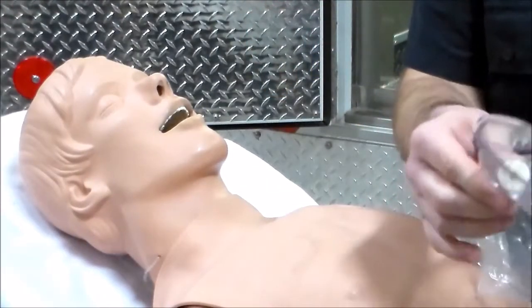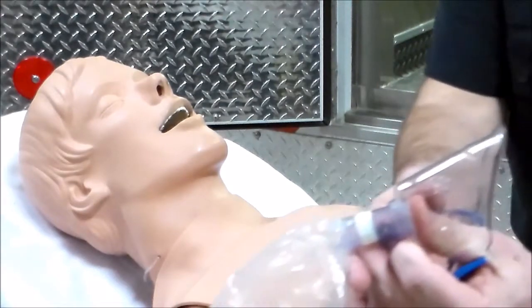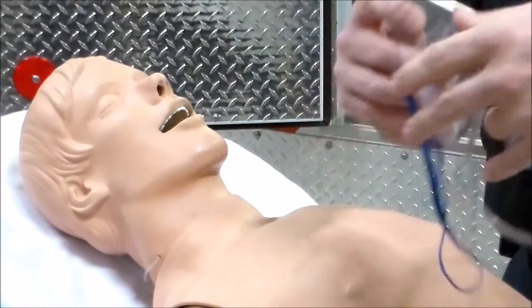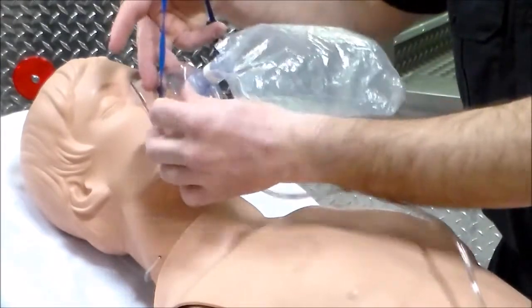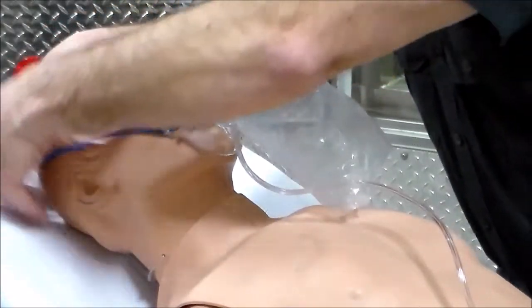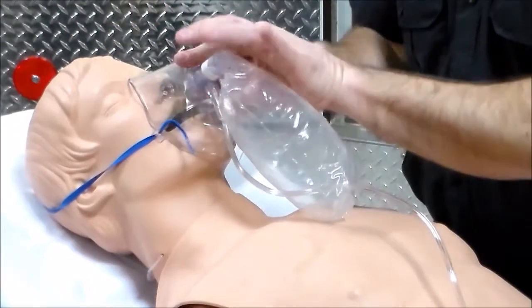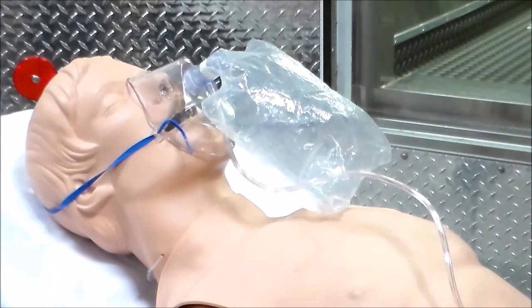For the non-rebreather, we place our finger right here to inflate the bag. Once the bag is inflated, we apply this to the patient's face — nose and mouth. We place it over, make sure the nose cups are snug, and snug it up. We've now applied a non-rebreather face mask.